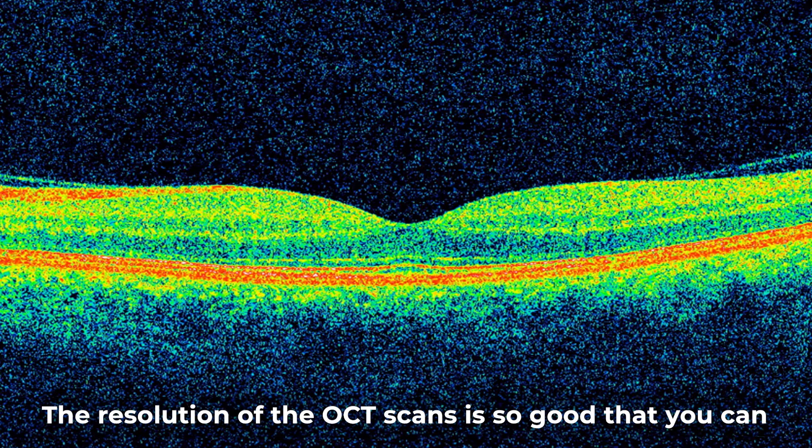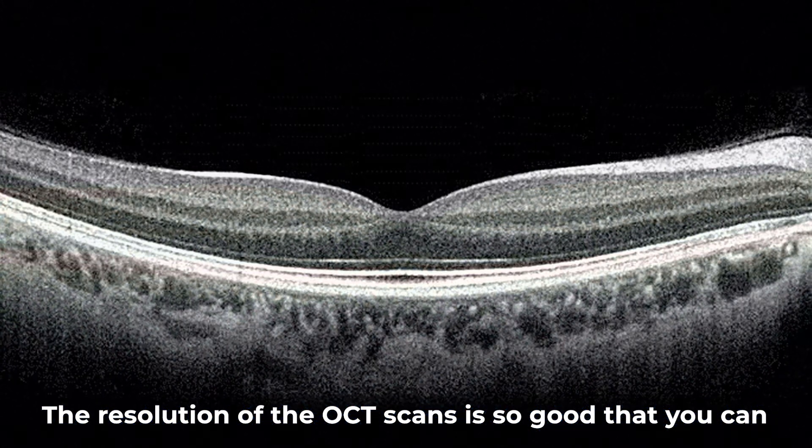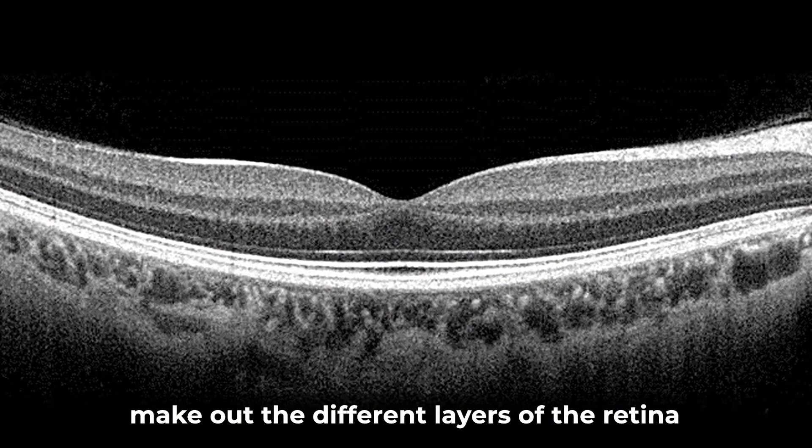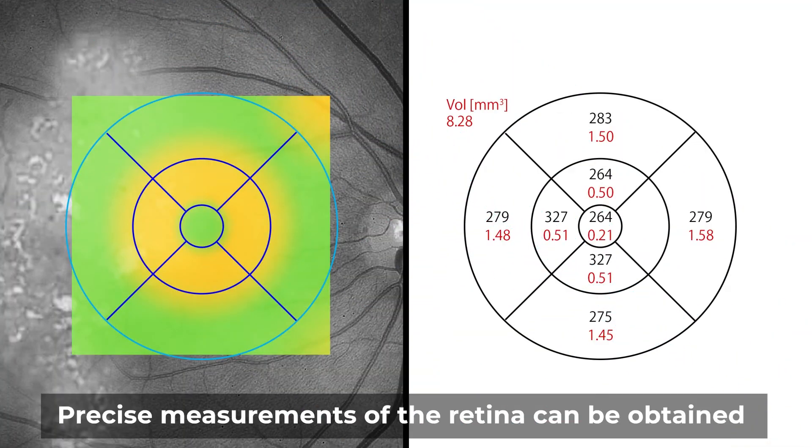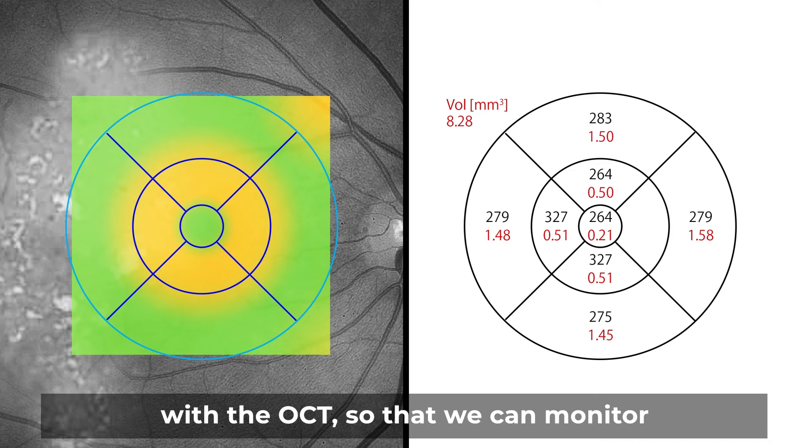The resolution of the OCT scans is so good that you can make out the different layers of the retina from the scans. Precise measurements of the retina can be obtained with the OCT so that we can monitor for any changes over time.